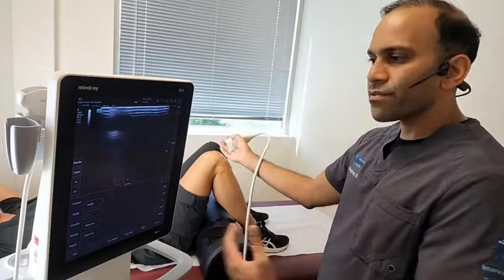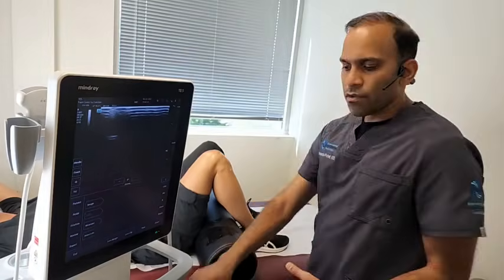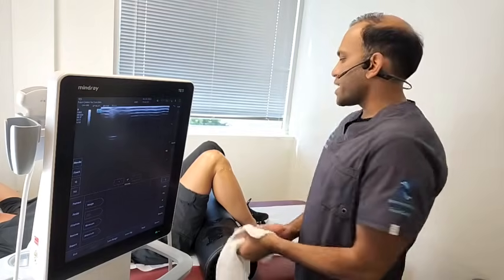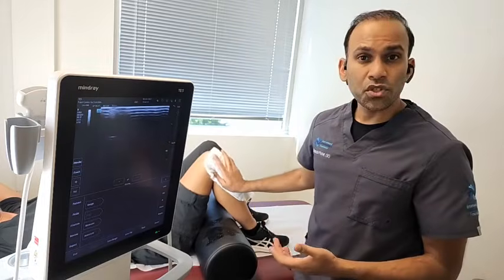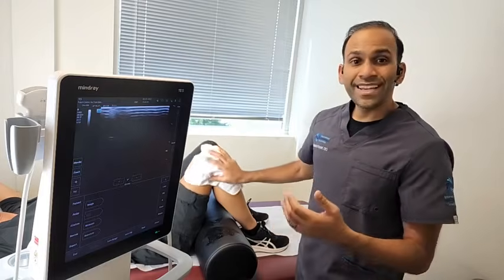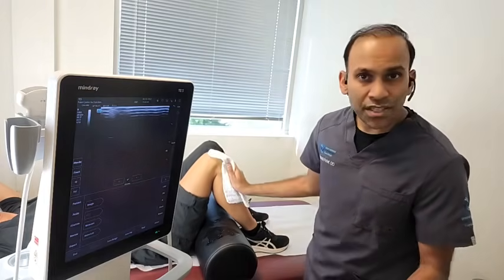But there's a lot of different structures. There's structures that I did not point out, but overall, there's a lot of different things that we can look at with ultrasound. It has a lot of potential benefit in looking at superficial structures, tendon injuries, ligament injuries, getting hints at what's going on inside of the knee with cartilage injuries and inflammation inside the knee.